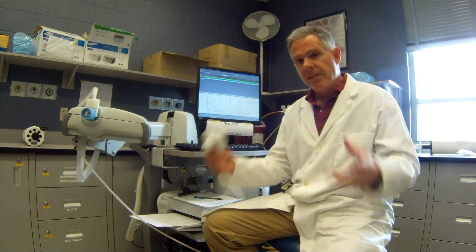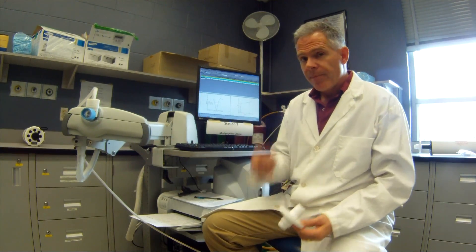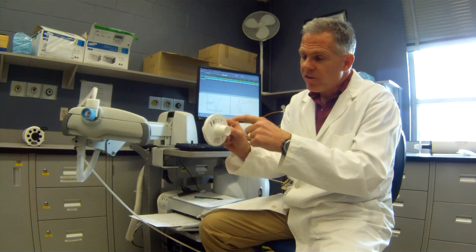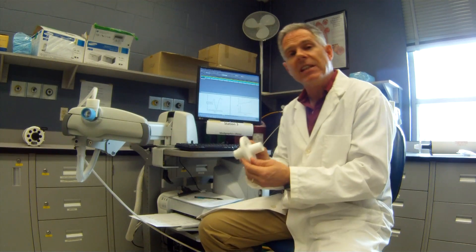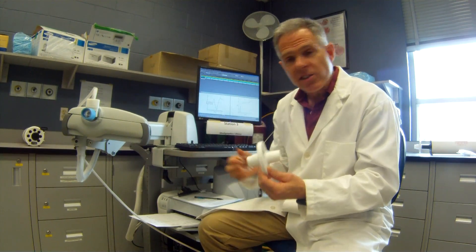It's a little bit different than a complete nitrogen washout where we're just doing it over one breath. So we're going to coach our patient using a mouthpiece. They got to get their teeth on the outside, make sure there's no obstructions to flow, and keeping a good seal. Like always, we'll have the nice nose clips on there.